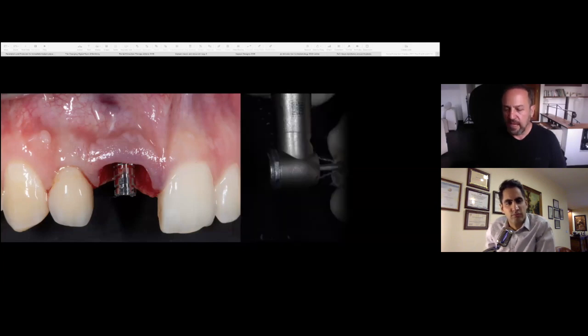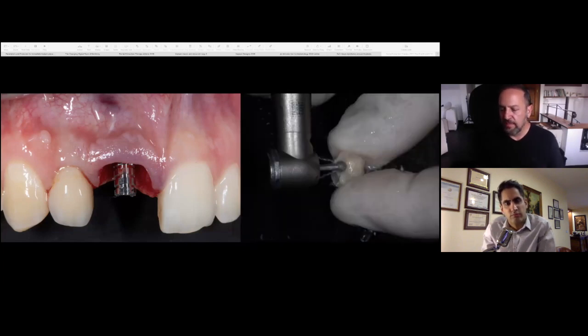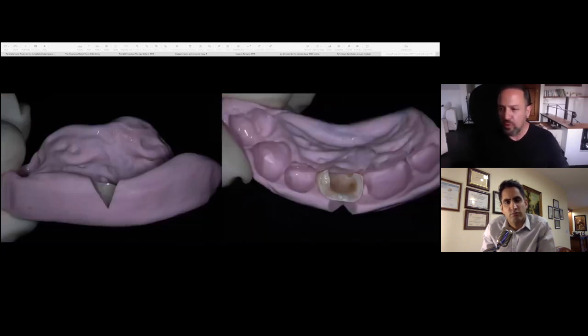back on. I drill out the tooth, completely open up the tooth, keep only the buccal facing. Before we started, we took an index, and I find this index works very, very well for me. I create this little V notch over here, just so that when I cure with my curing light, there's space for the curing light to work.